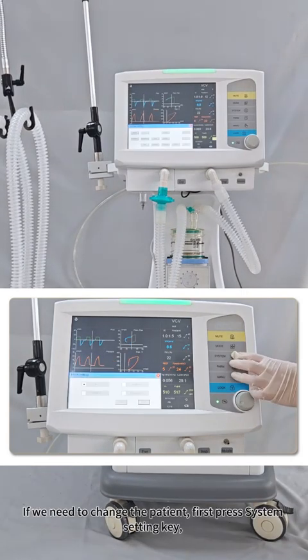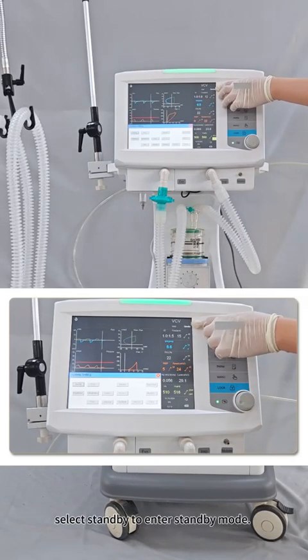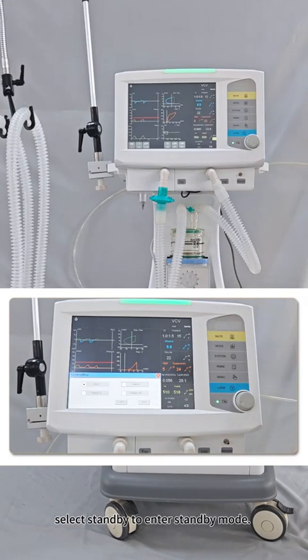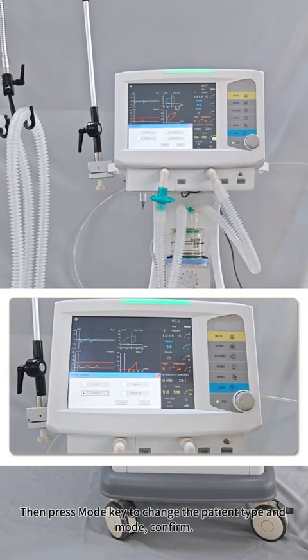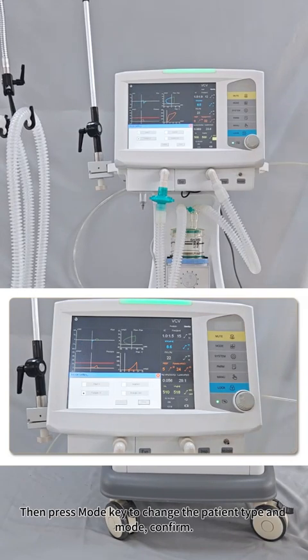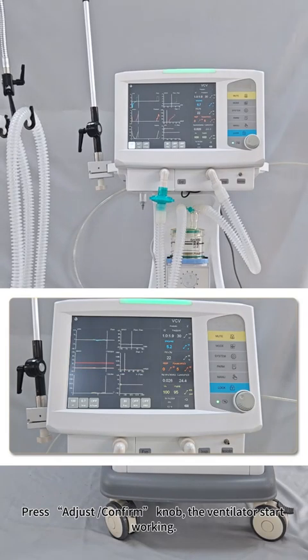If we need to change the patient, first press the System Setting key, select Standby to enter standby mode. Then press the Mode key to change the patient type and mode, confirm. Press the Adjust/Confirm knob, and the ventilator starts working.